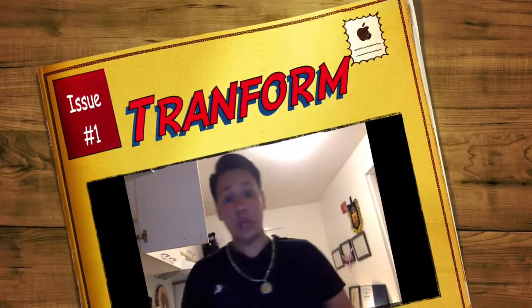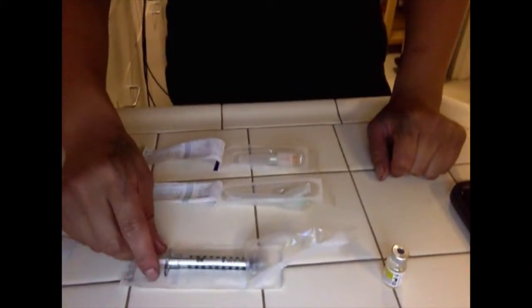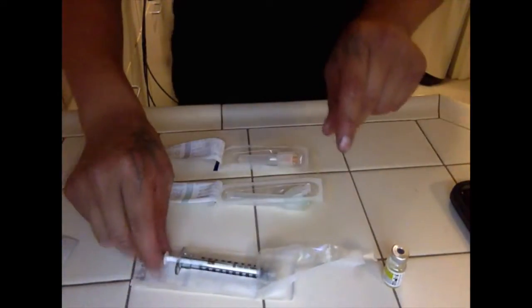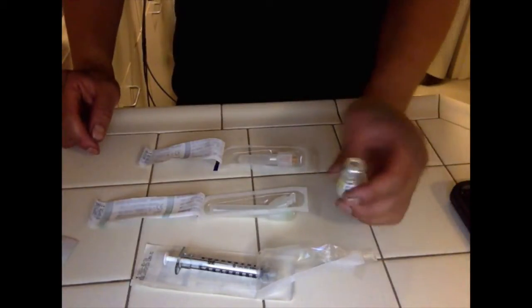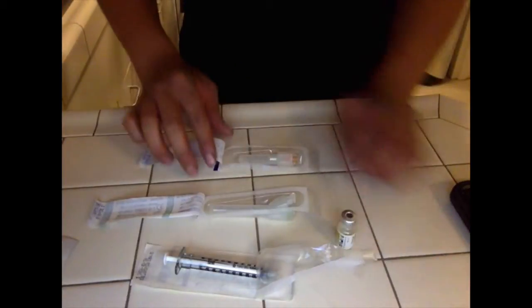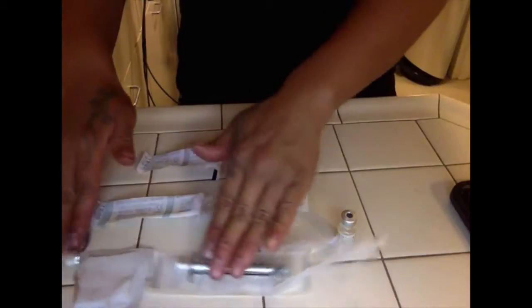I'm doing my first shot by myself. This is a syringe that I'm gonna use. This is a bigger needle that's gonna go into the testosterone bottle to draw up the testosterone, and this is the needle that's gonna go inside my body. And of course, this is the sanitizer.